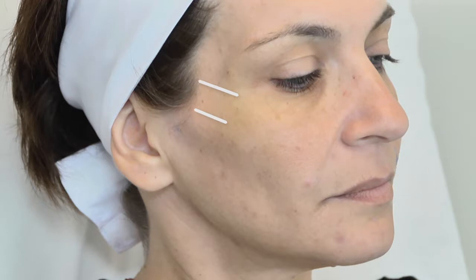After disinfecting, make a pre-hole with a needle to the zygomatic arch until the dermic-hypodermic junction and insert the cannula parallel to the cutaneous plane in the desired injection plane. Sometimes fibrosis can be felt at the temporal crest. If this creates a groove laterally to the crest when the temporal fold has been corrected by injection, it could be useful to use a bolus in this depression. Therefore, it is advised to use precaution to fix this. A few small boluses by needle followed by a massage.